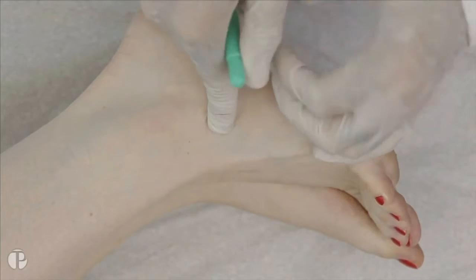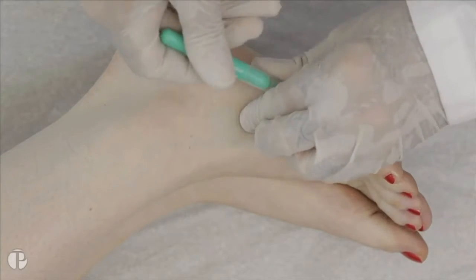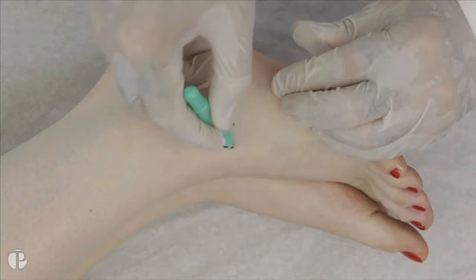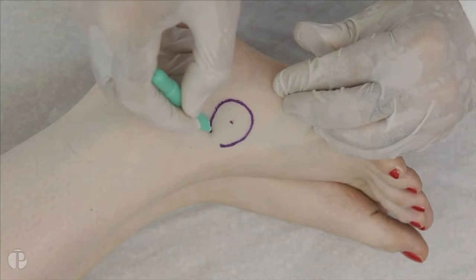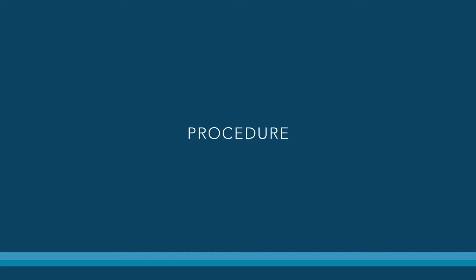The standard foot site is located on the dorsum of the foot over the extensor digitorum brevis muscle.